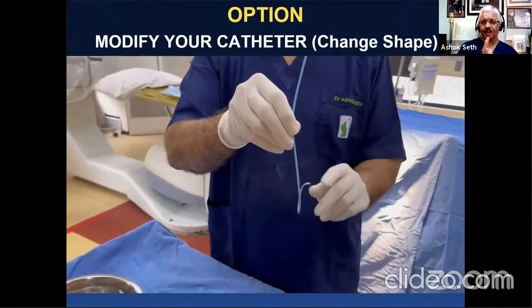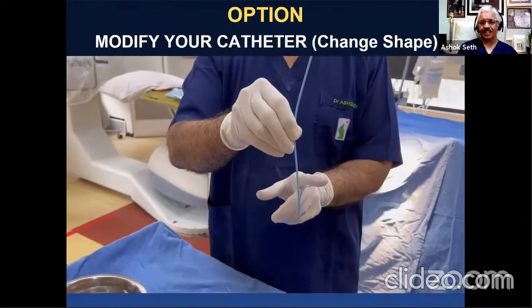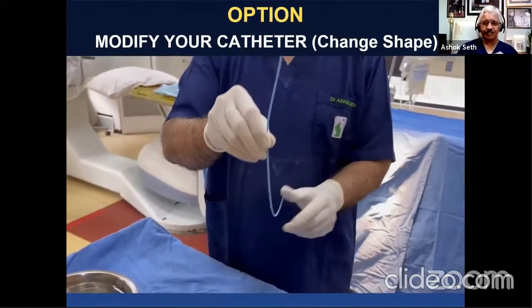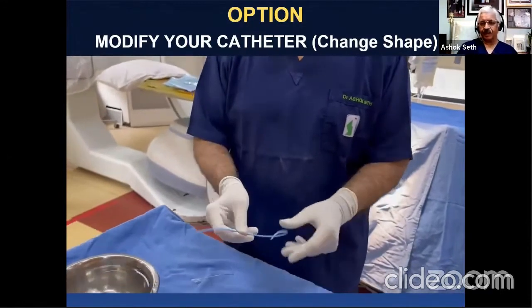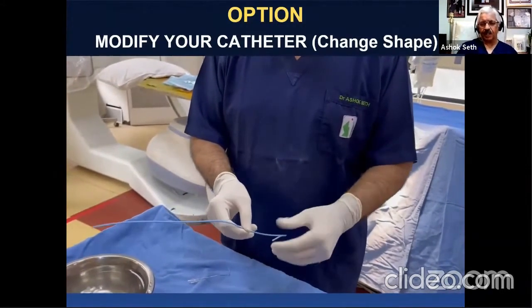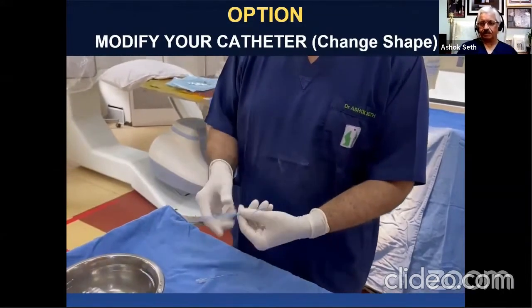So, if you look at it in the RAO projection, it sits pointing anteriorly. Look at it in the LAO projection, it's angulated anteriorly. And it's firm. This is what I'm showing, that it won't soften up as you put it into the blood, and you can't take away the shape.